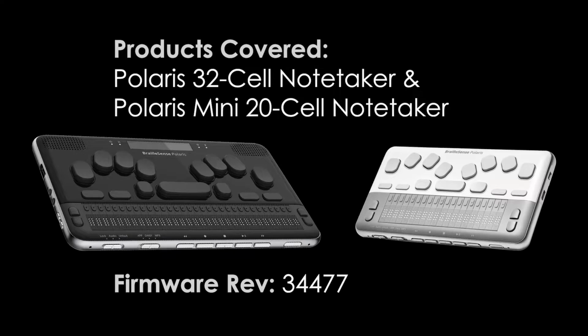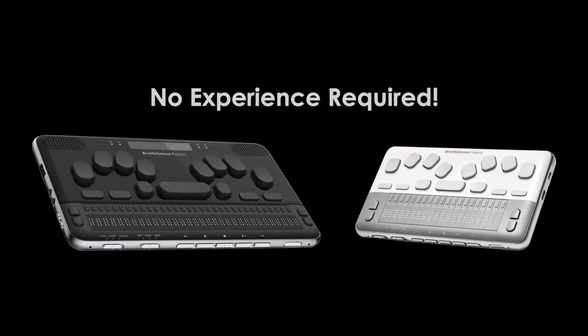First, I'm working on a Braille Sense Polaris 32-cell note taker. If you're using a Polaris Mini, don't worry, the keys and the keystrokes are the same. I'm also using firmware version 34477, so you may see a slightly different menu structure depending on your firmware version, but the settings we're going to cover today should be no different across firmware versions. Lastly, this video is for those who are new to the Polaris or those who just want to brush up on how to do certain things, so you won't need any experience with the Polaris to follow along.